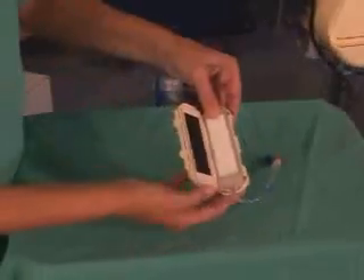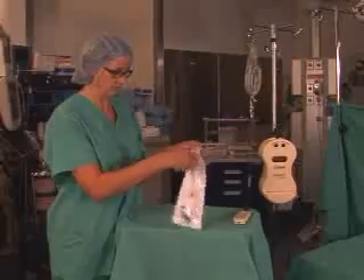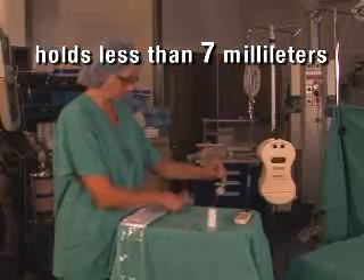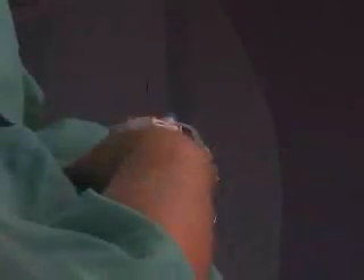The Buddy Fluid Warmer is a miniature near-patient dry heat fluid warmer with an ingenious disposable set designed for safe and effective fluid warming. The tiny disposable holds less than 7 milliliters including the tubing, and can be used with any standard IV tubing.